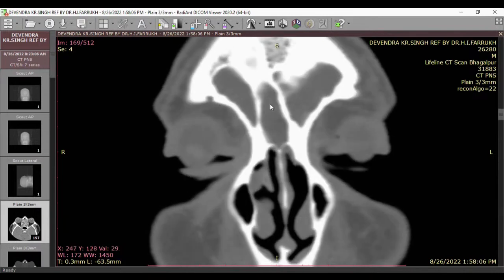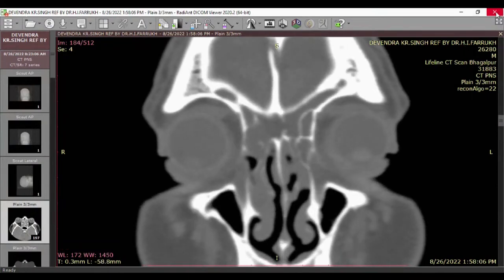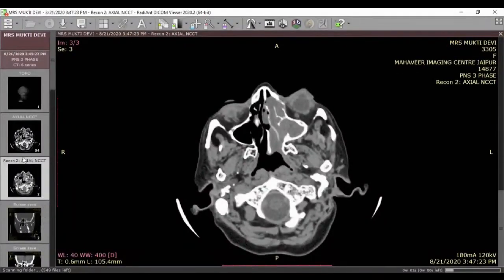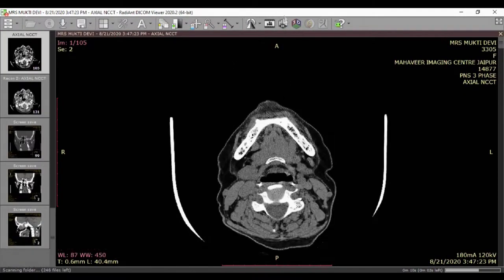That is the treatment. See the value of dynamic radiology, you can actually get to know how this cell is communicating to the frontal sinus. If this frontal sinus drainage pathway is widened and this cell is communicated, that's the final answer to this problem. So we should be able to know which one is the frontal sinus and which is the intersinus septal cell. Again, this example in the series of examples, this is one of the classic examples of frontobullar cells, I can say.